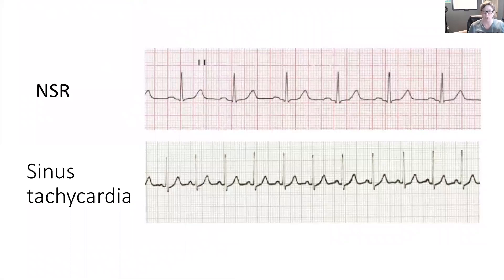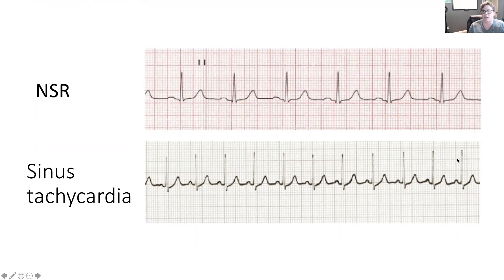When comparing the normal sinus rhythm strip on top with the sinus tachycardia strip on the bottom, you can immediately see there are more QRS complexes in the bottom strip. Using a six-second strip, count the complexes: 1, 2, 3, 4, 5, 6, 7, 8, 9, 10, 11 — multiply by 10 for a heart rate of 110. Compare that to the normal sinus rhythm: 1, 2, 3, 4, 5, 6 — a heart rate of 60. The characteristic feature of sinus tachycardia is that all waveforms and intervals are present but faster than 100 beats per minute.